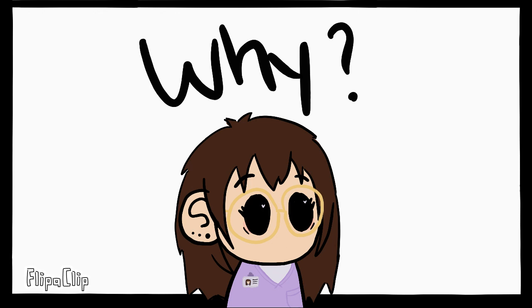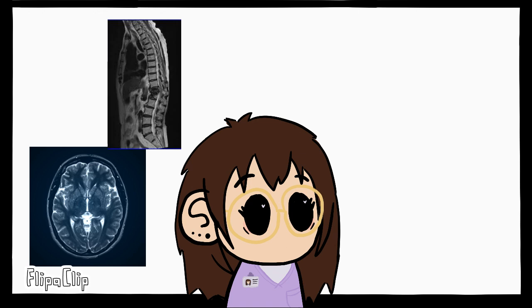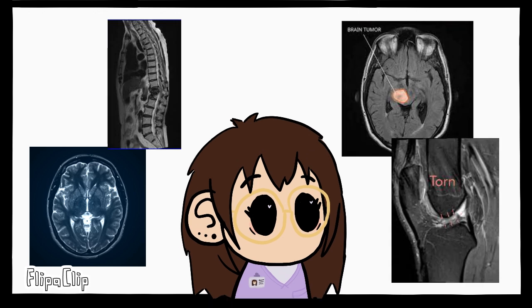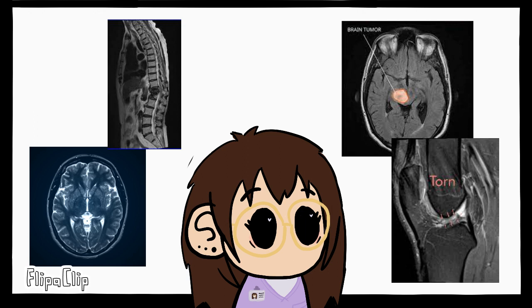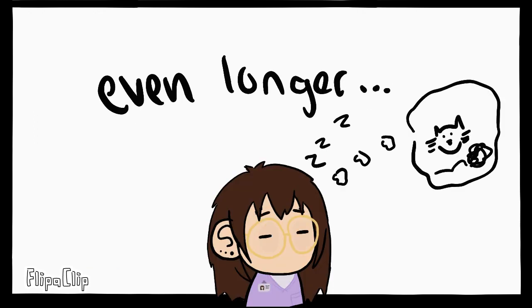MRIs can take very detailed images of almost everything in the body, but it's mainly used for imaging of the brain, spinal cord, and even tumors and torn ligaments. The reason why we don't use MRIs as often is because of how long it takes. MRIs can take up to 30 minutes to an hour or even longer.